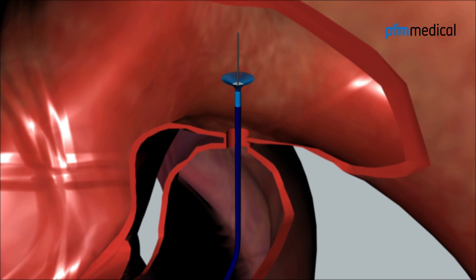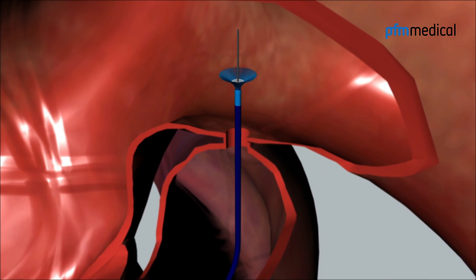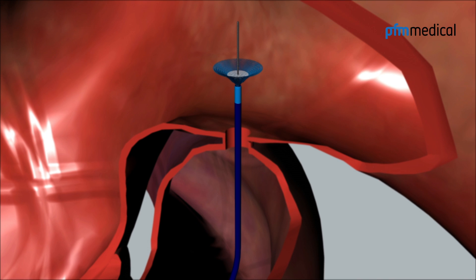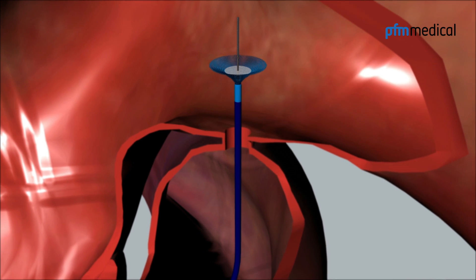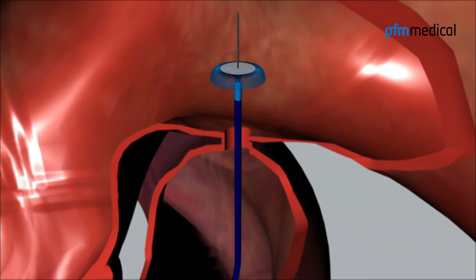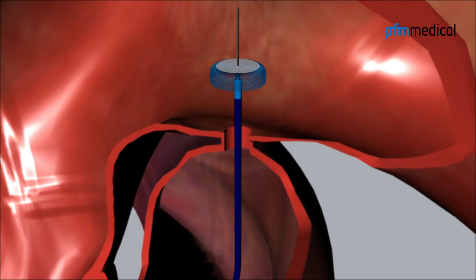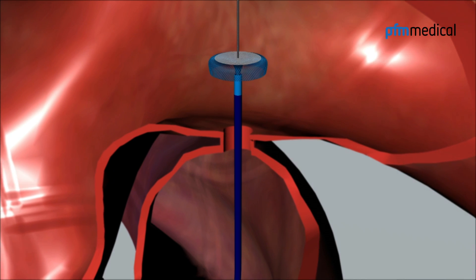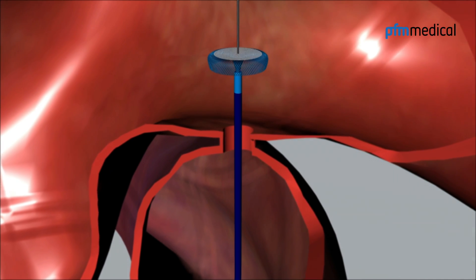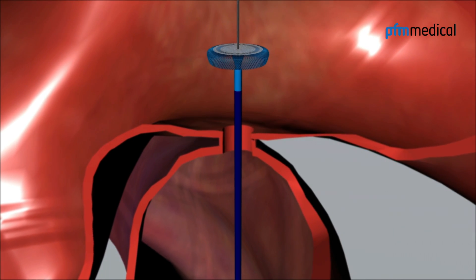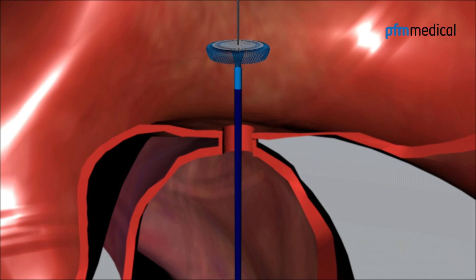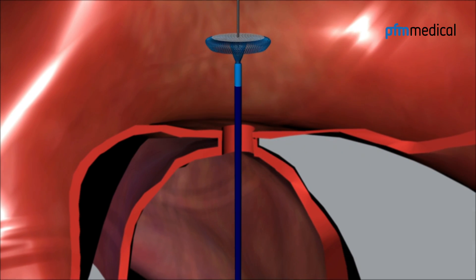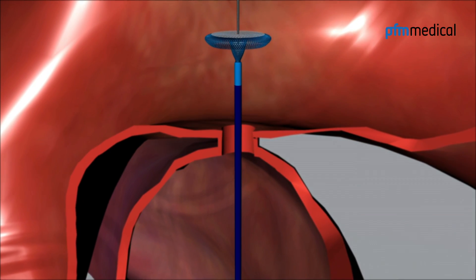The distal disc expands slowly inside the aorta, and the unique configuration of the reverse part of the distal disc can be seen. The stent part is only partly configured at this point.